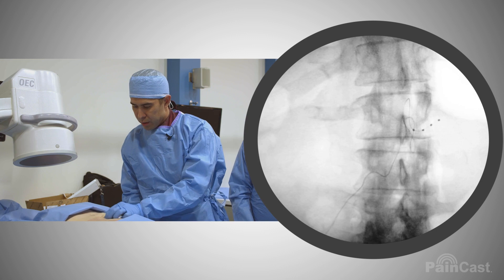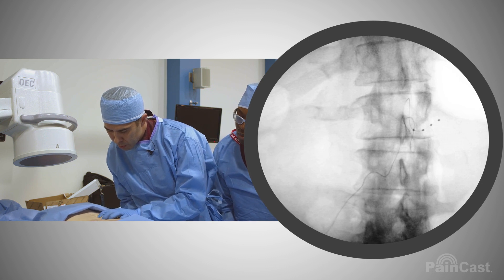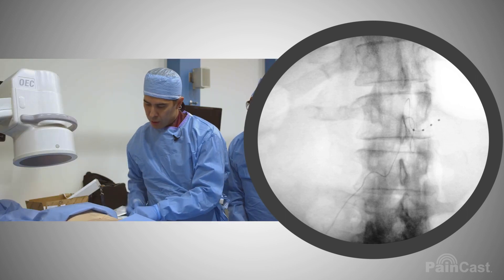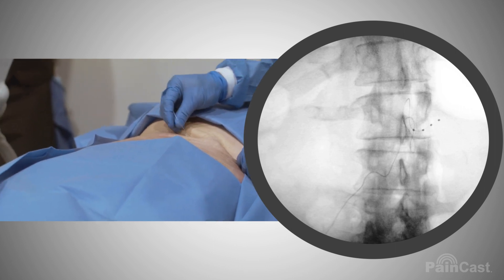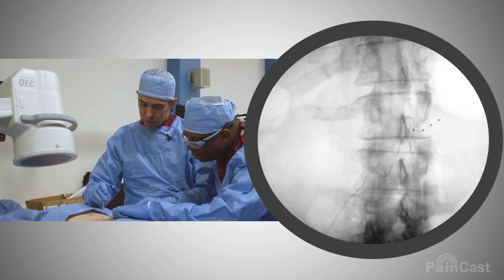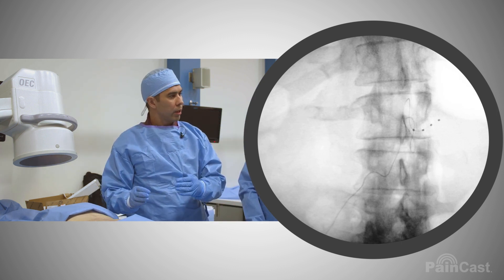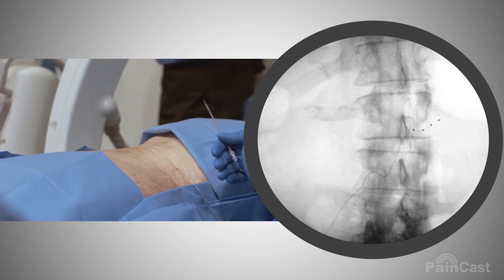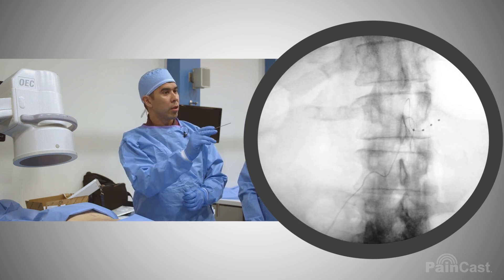Instead of making an incision in the midline, we actually published this a couple years ago — we use a tunneled epidural catheter technique, and you go from the pocket through. Now there's no midline incision. In the lower lumbar segments, that's good. But in the upper lumbar and lower thoracic, because that distance is farther and the movement of that thoracolumbar junction, you have to be more worried about lead migration. So we would put loops below as well, but we would also anchor these — we'd make a midline incision and anchor at that level.